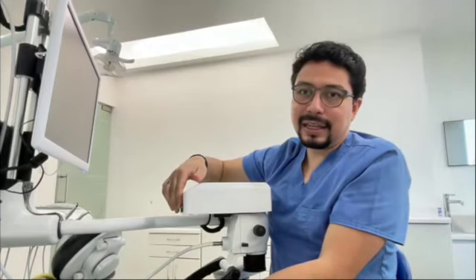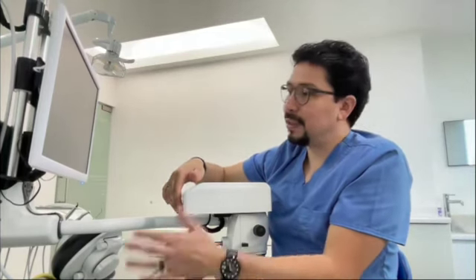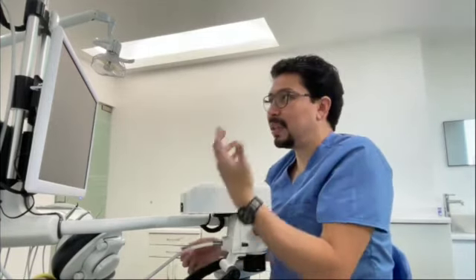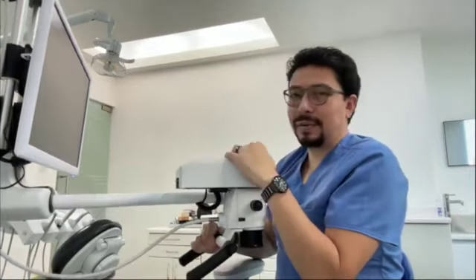And I can take the screen going down as well. So this is a motorized system. The vertical angulation of the screen, you can change it, it is a manual system. It's not motorized, but we will manage that for having the best quality of 3D images.